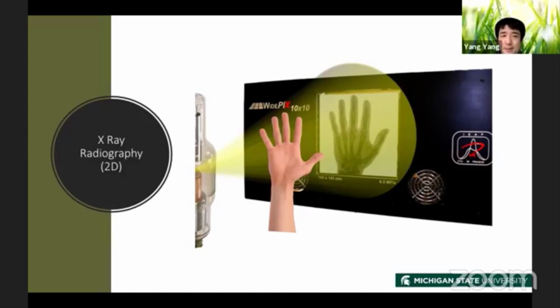All right, so this is the basic 2D X-ray radiography, which is just like you project the shadow of the hand with the ability of penetration. But the problem with the 2D radiography is that it just gives us the width and height of the object. We have no information about the depth.